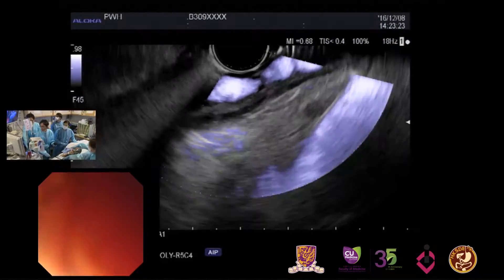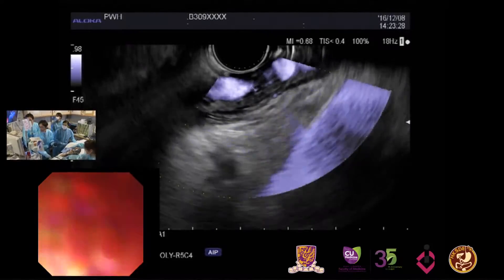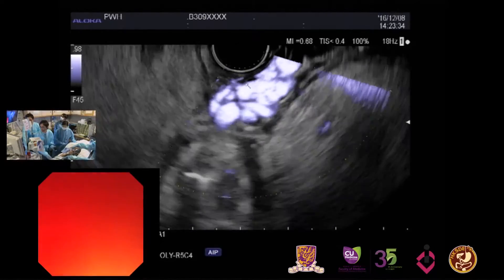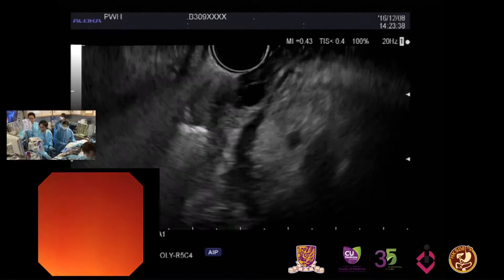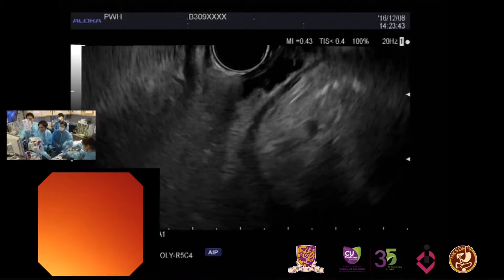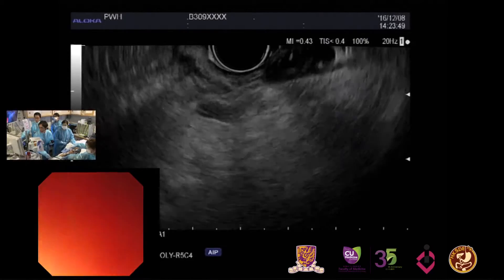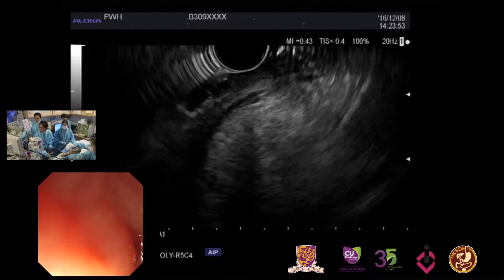Yes, near the cursor. Since the stigmata of bleeding is actually on the gastric varices, I propose to perform an EUS-guided glue injection for therapy. Are the gastric varices and esophageal varices communicating, or are they not connected together?